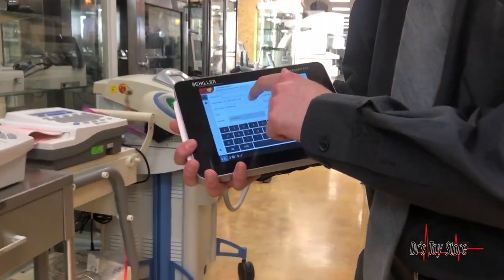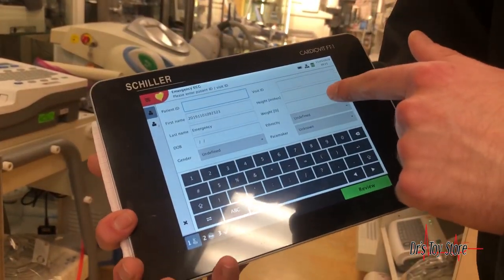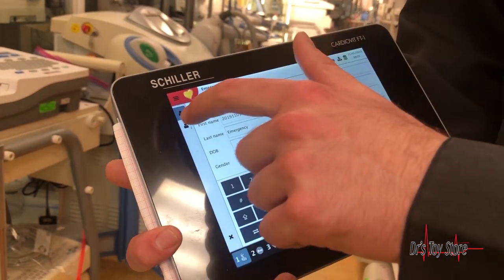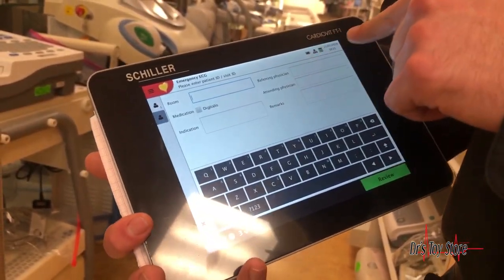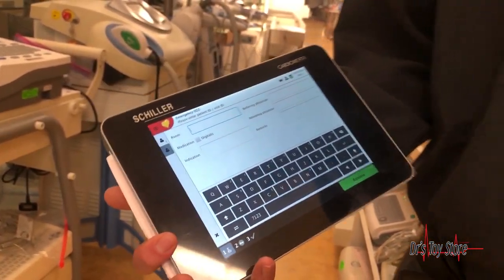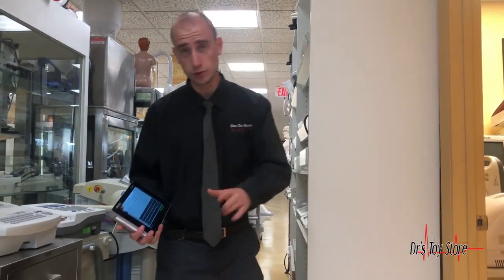You can get patient ID — first name, last name, date of birth, gender, visit ID. On the second page you have the room number, indication, and referring physician, so you can see which physician or nurse took the EKG.